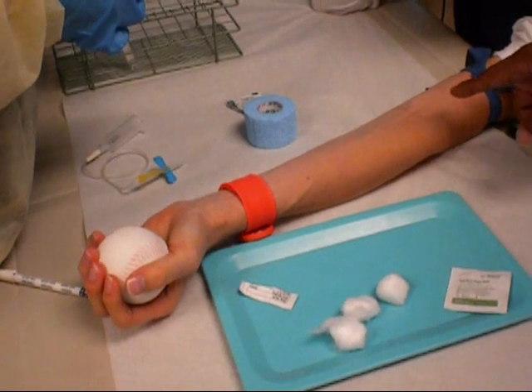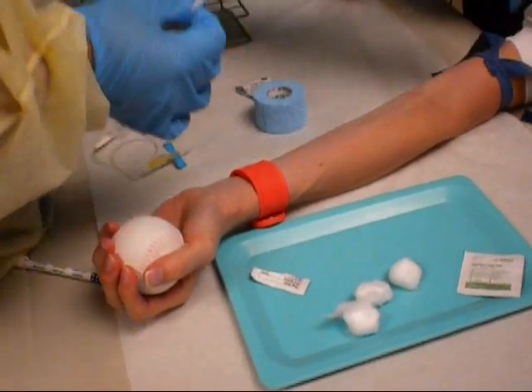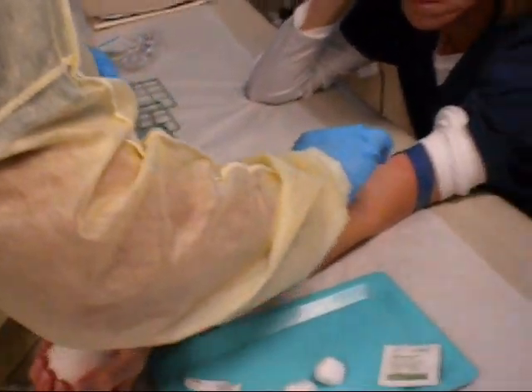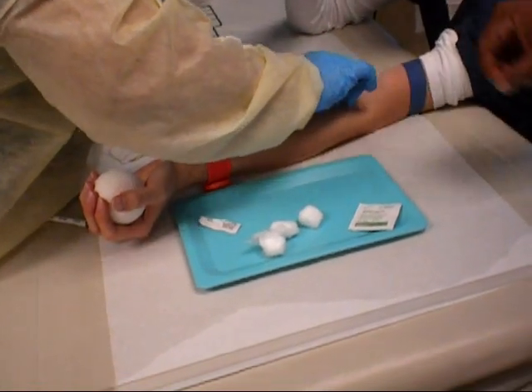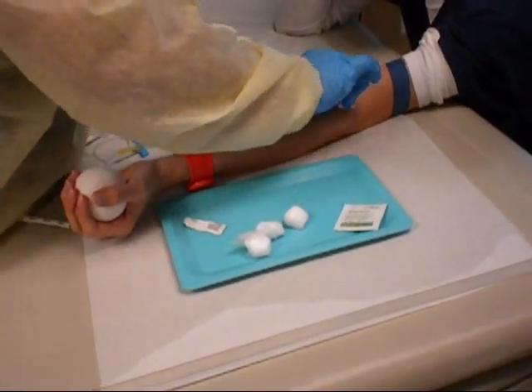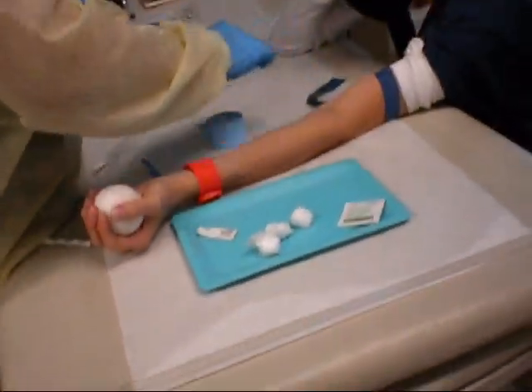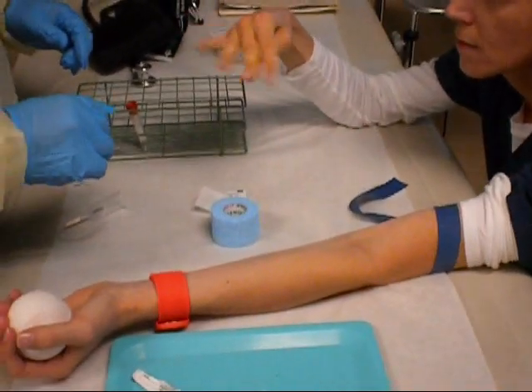So now what you're going to do is, if you're going for that vein, you know you're going for that one. We can take this off because we can only leave that on for two minutes. So not down — you're going to do it in a circle. The reason for that is because you want to take the debris and everything that's there and work it outwards from the middle where you're going to go. If you want to go in, I'll be with the right hand.